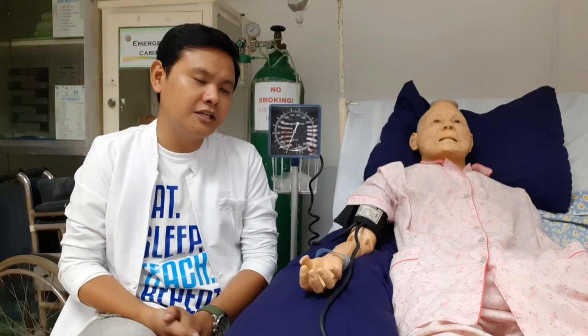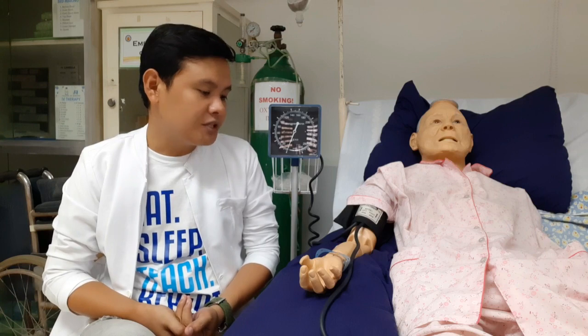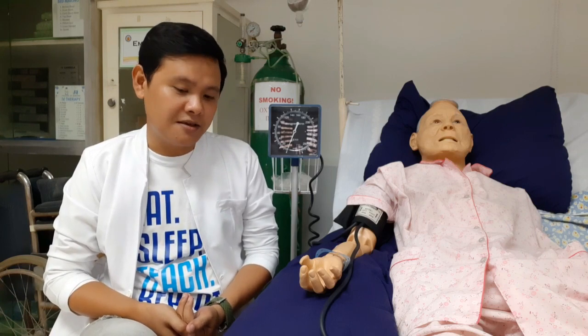Next, we have to determine also the policies and procedure na meron sa isang facility or hospital kung saan tayo magjo-duty. What else? We also need to check, or should I say determine, kung ano yung medication ng pasyente natin. Medication na tinitake niya. So, saan natin makikita yun? Simple lang, dun sa chart ng client natin. Because there are certain medications that may increase or may decrease the blood pressure, such as furosemide. Ang furosemide po is nakakapagpababa ng BP. So, kailangan i-check natin ano yung mga medications na pwedeng maka-alter dito sa gagawin nating measurement.